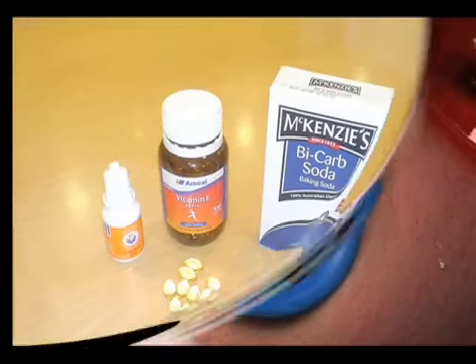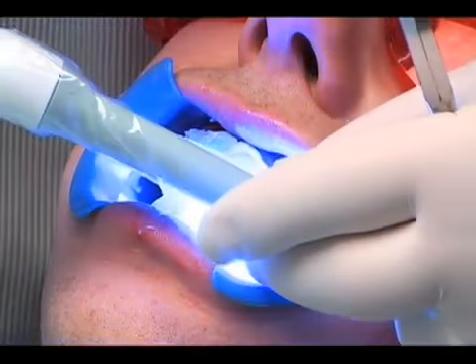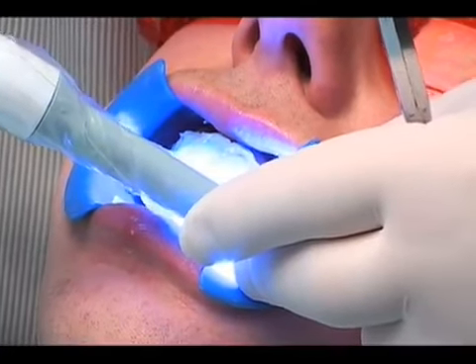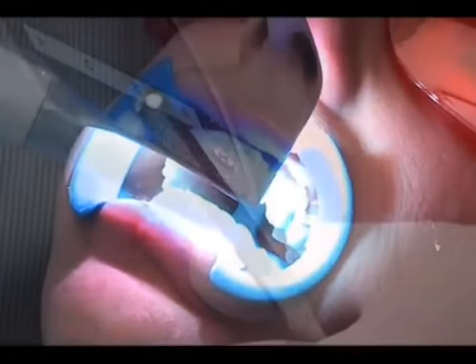If the gel comes into contact with soft tissue, vitamin E or a slurry of sodium bicarbonate can be applied to relieve the irritation. This relief will be immediate, and you may continue the whitening procedure if the patient is comfortable. At this stage, a curing light can be used to speed up the reaction, such as the SDI Radii Plus with the bleach attachment. Alternative bleaching lights may also be used.